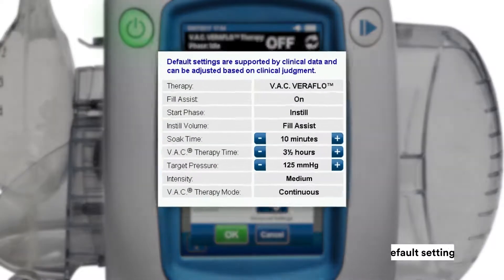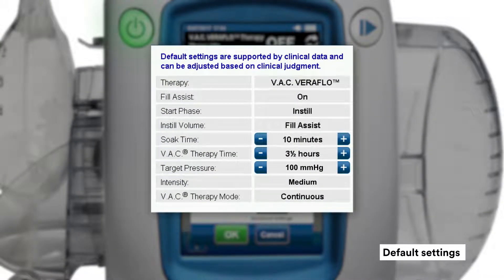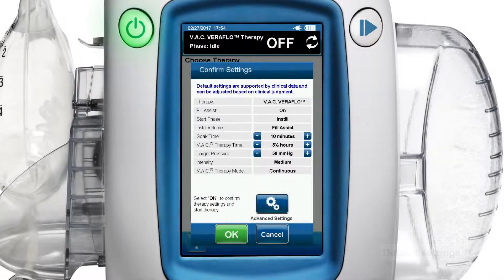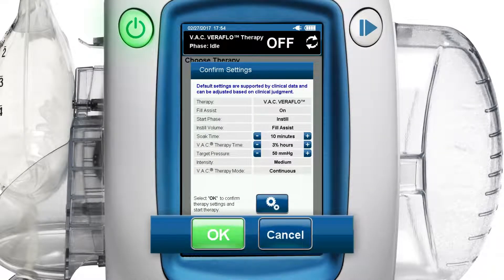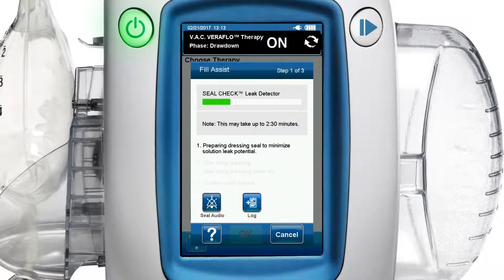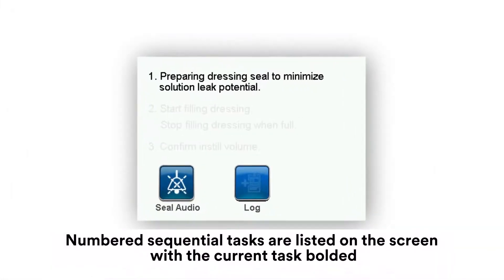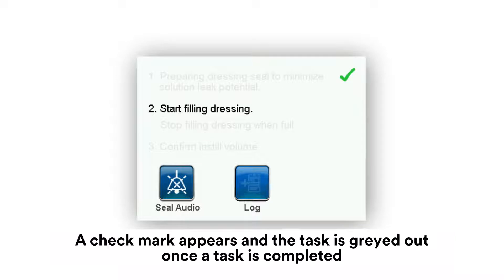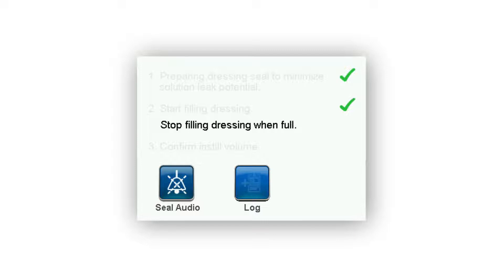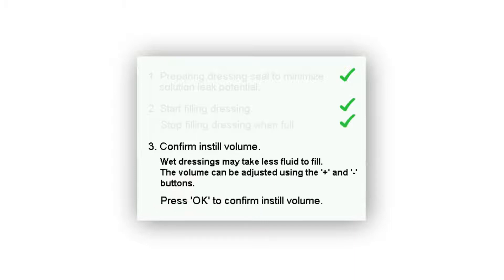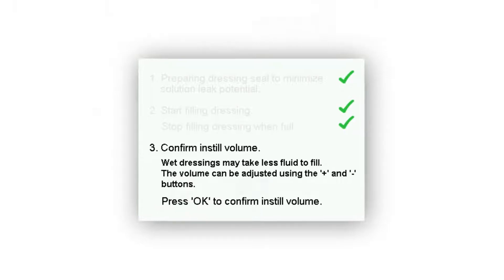You can adjust the variables on the confirm settings screen using the plus or minus signs. Next, press the green OK button to accept settings and begin VARIFLOW therapy. Step 1 of 3 of the fill assist screen appears, drawing down the dressing to prepare the dressing seal to minimize solution leak potential. Numbered sequential tasks are listed on the screen with the current task bolded. A check mark appears and that task is greyed out once a task is completed. The therapy unit automatically advances to the next task and displays the next instructions, which will be visible and bolded.